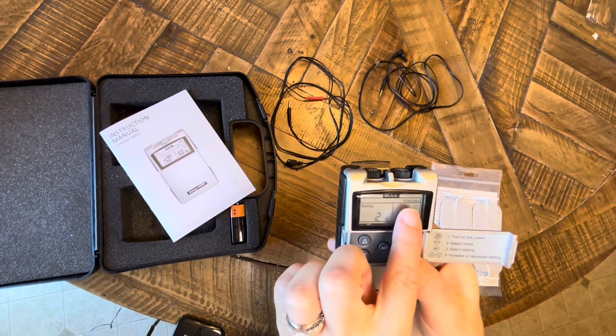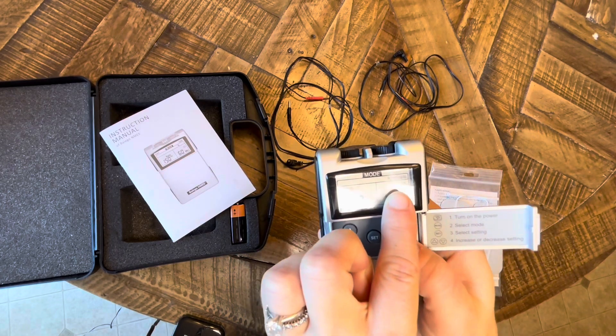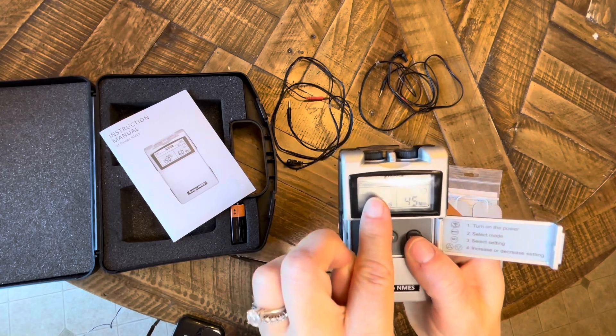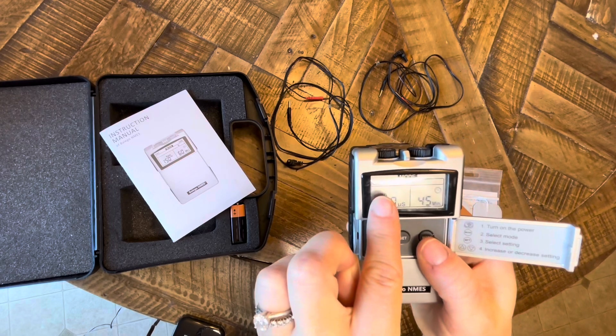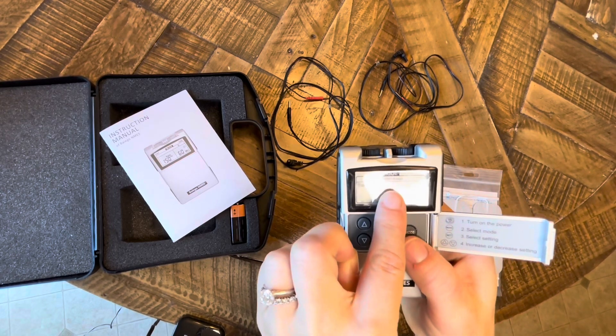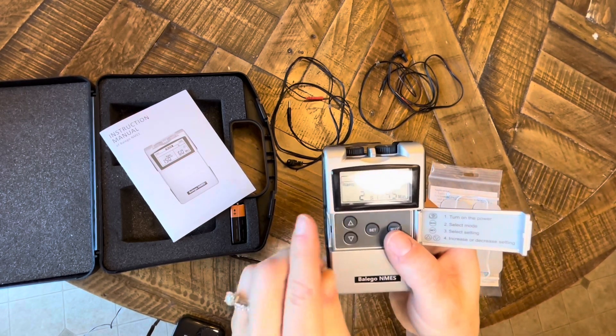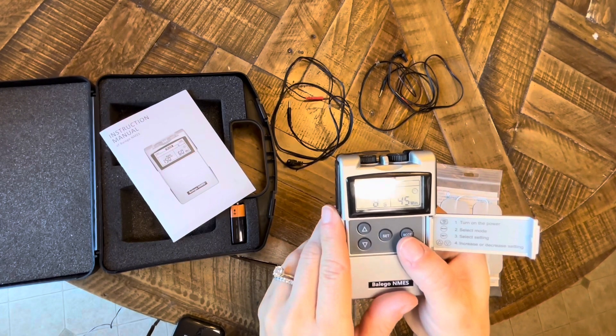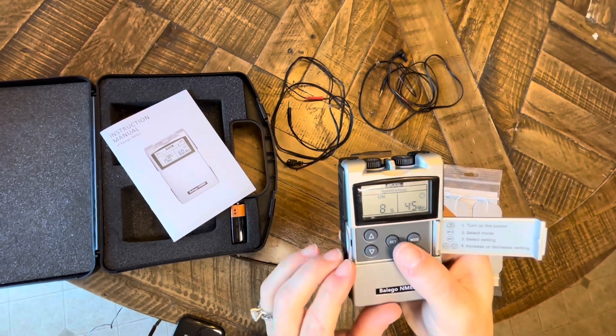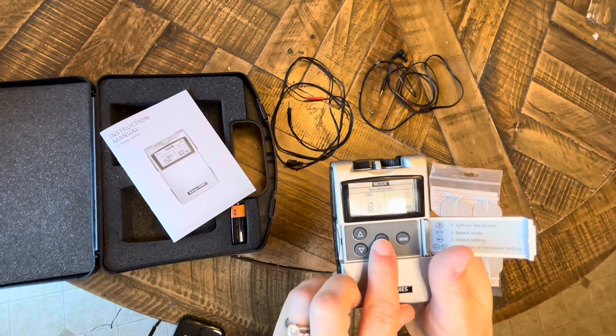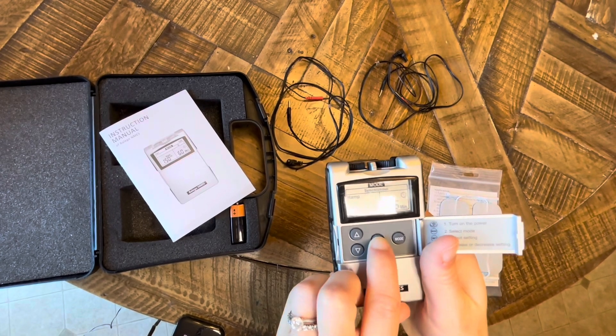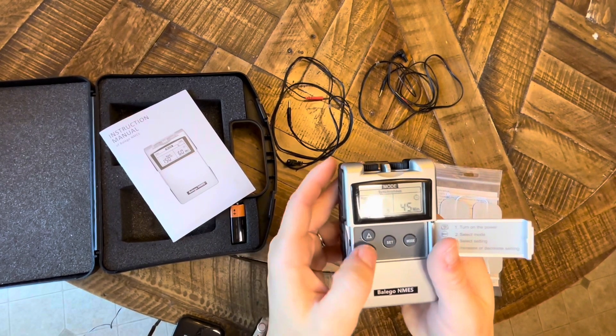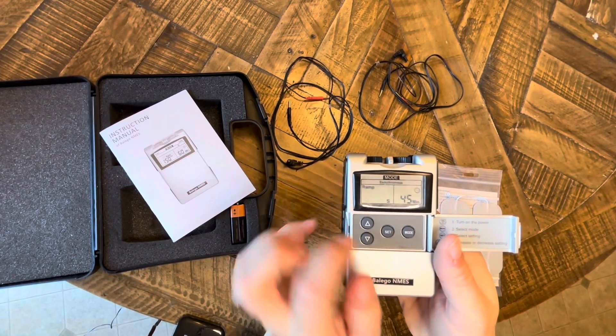That's where you're going to be setting your parameters. So you first press the mode and that's going to change your mode. There's three different modes that you can use: constant, synchronous, and alternate. If you're using one channel I usually do synchronous. You could do alternate since you're not using the other channel as well, it'd be the same thing.